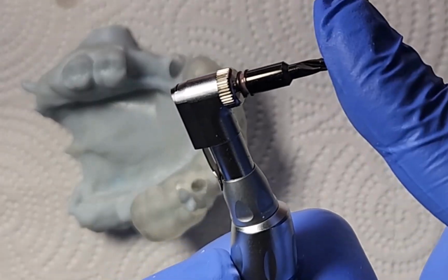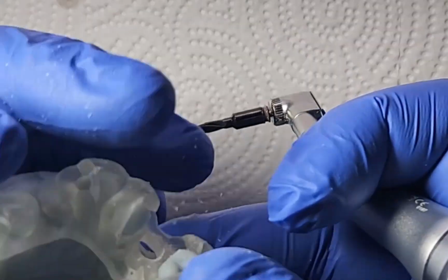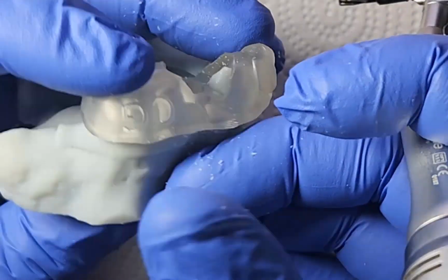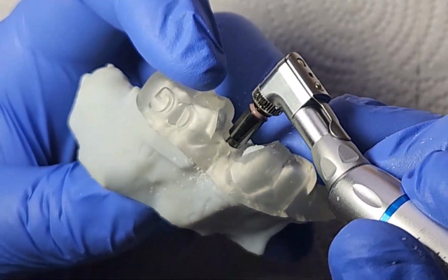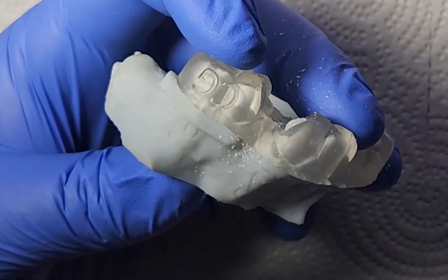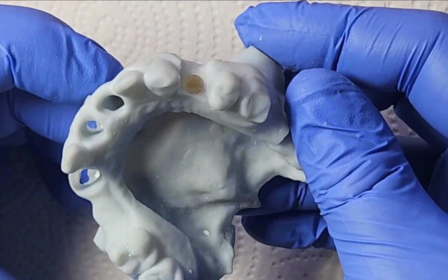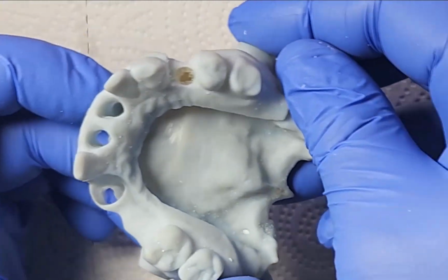So we're not going to go any longer than this. A 10mm is our final length, and depending on the case, you might opt to just stop at this drill. Right, you might want to undersize the osteotomy. And so you can see here we've got our osteotomy created in the site.